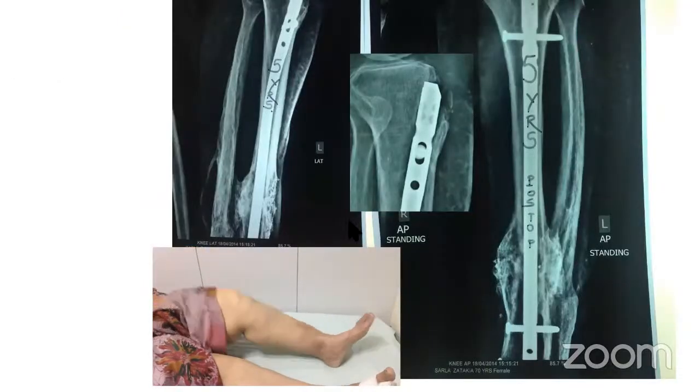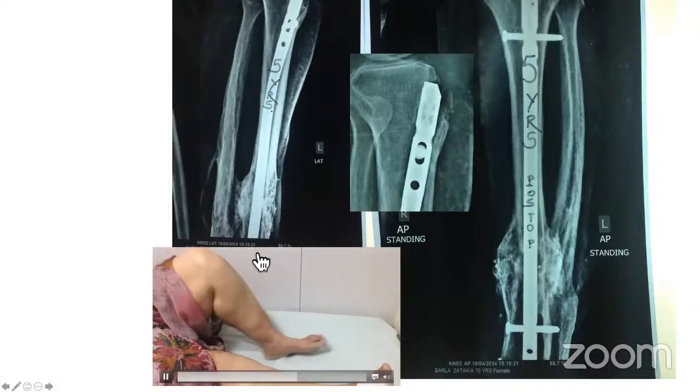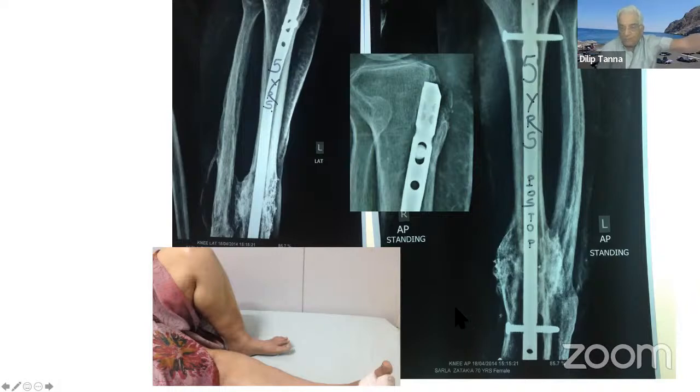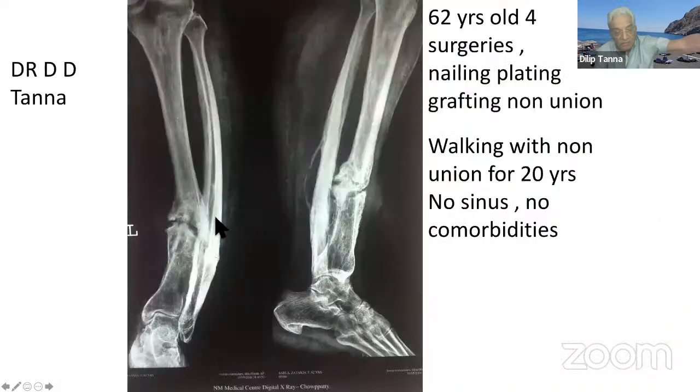Here it is. I did this, except at that stage I was not doing a double fixation. This was in 2014. Nail was done. Shingling is the one which I feel is the most important part. So the shingling was done here. The whole shingling is done here.